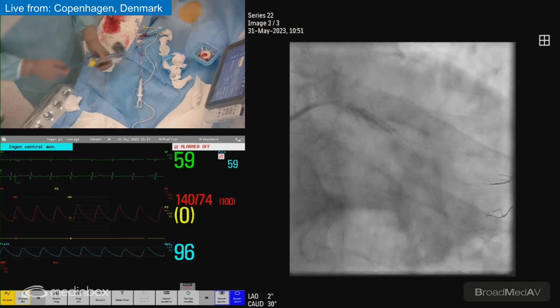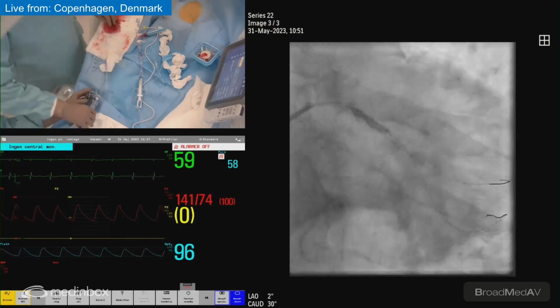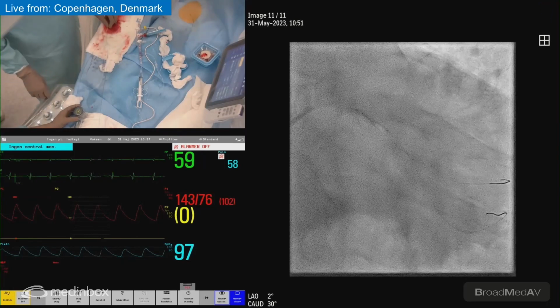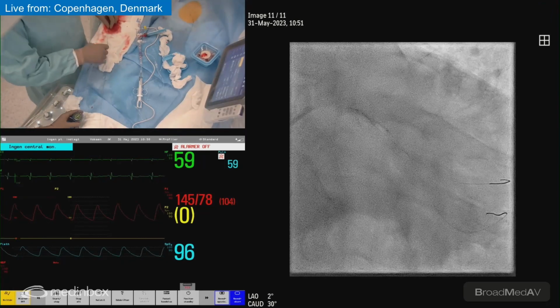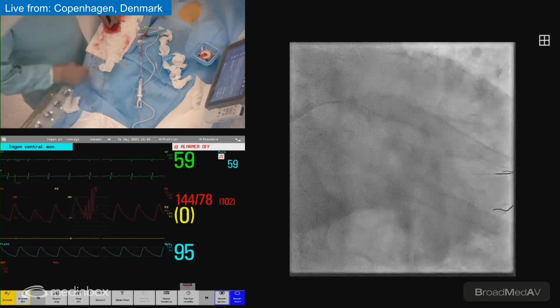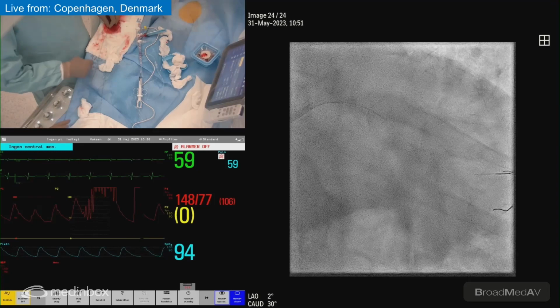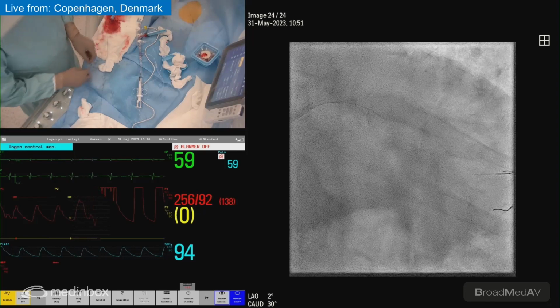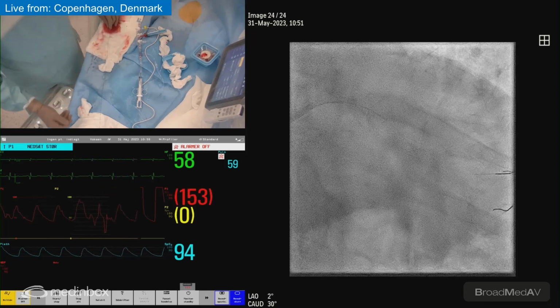No, I don't think you are exactly where you want it to stand. 2.75 38. So next step will be the distal stent, which will be extended across the marginal branch.